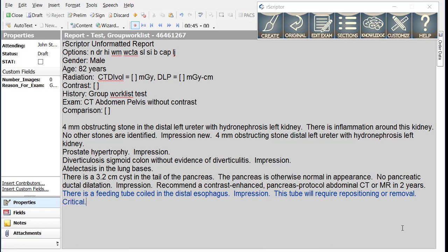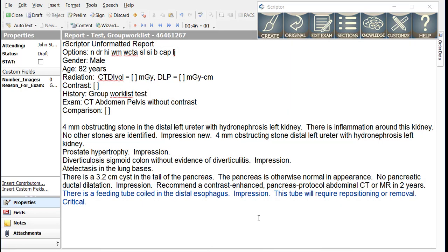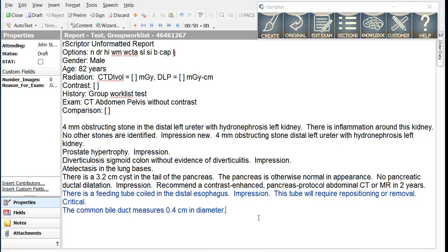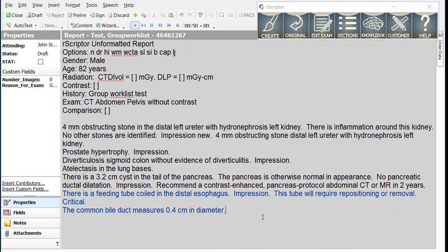Next line. Now let's add a common bile duct measurement. The common bile duct measures 0.4 cm in diameter period. Remember that with R-Scripter we typically only dictate positive findings. R-Scripter assumes that there is something wrong with the patient unless you add the modifier negative period. Let's add that modifier to this sentence. Negative period.